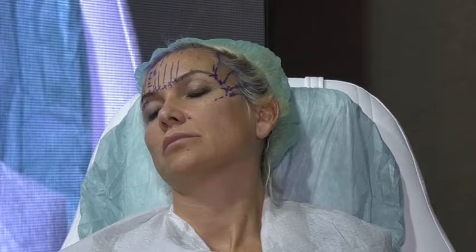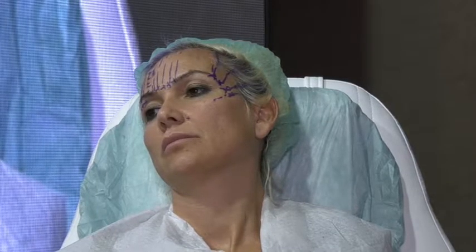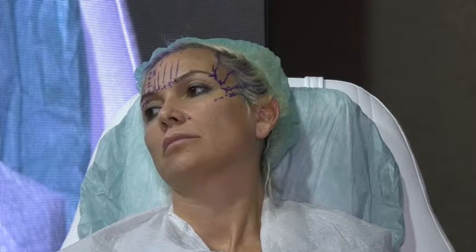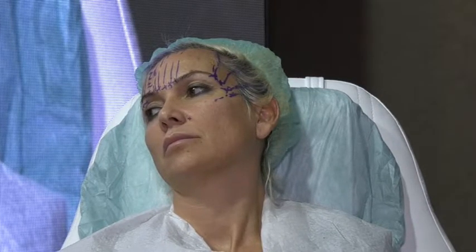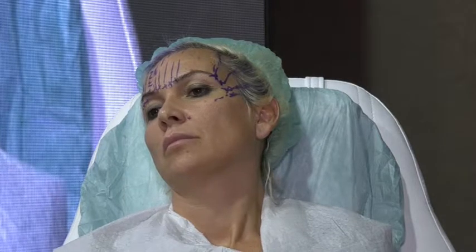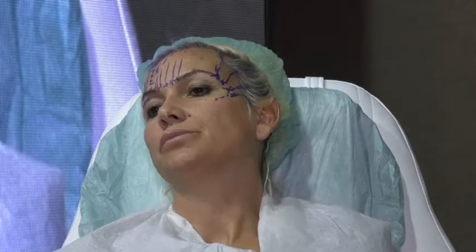That's the first entry point: half a centimeter lateral to the nasolabial, so you can lift the nasolabial and take it with you, at the level of the base of the nose. Does the nasolabial start at the base of the nose? Where does the nasolabial start? At the alar. So why didn't I put my first thread at the level of the alar?